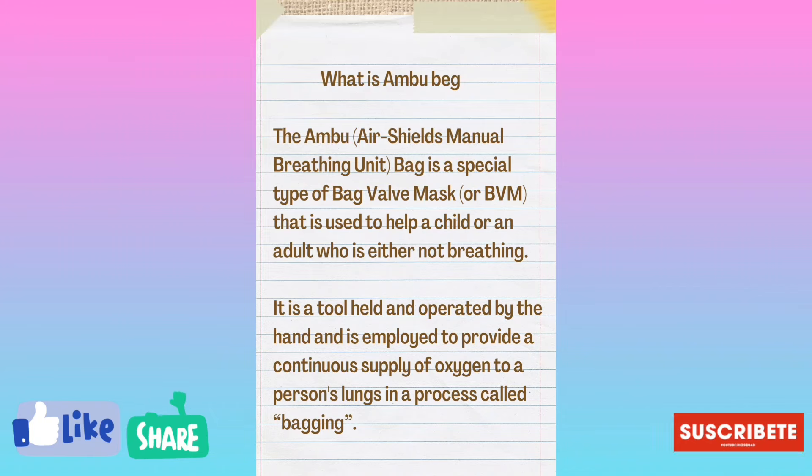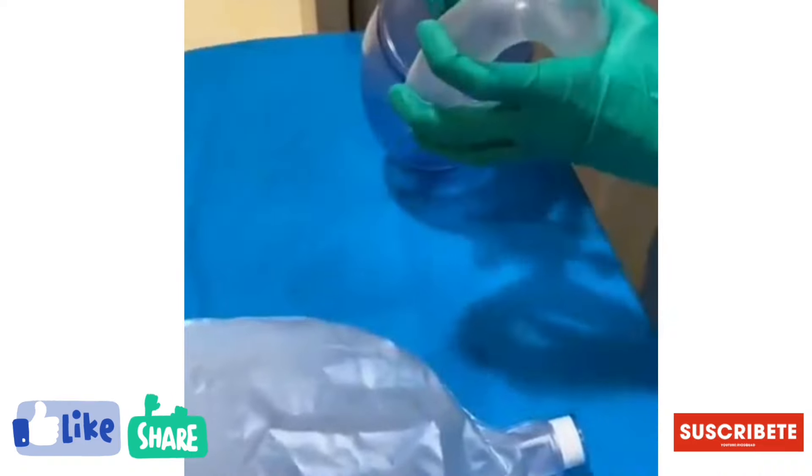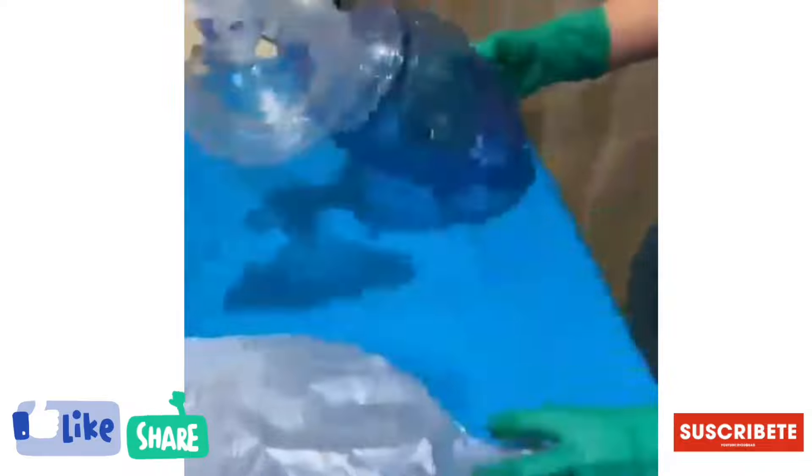The Ambu Bag is a special type of Bag Valve Mask, or BVM, that is used to help a child or adult who is either not breathing. It is a tool held and operated by the hand and is employed to provide a continuous supply of oxygen to a person's lungs in a process called bagging.